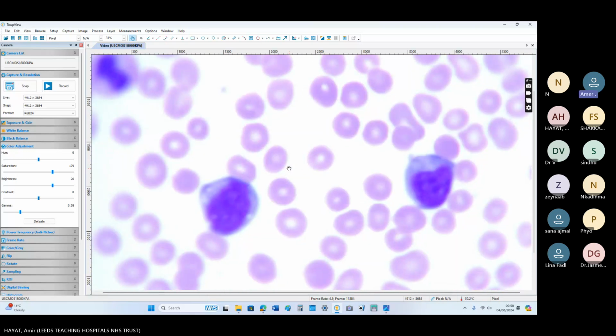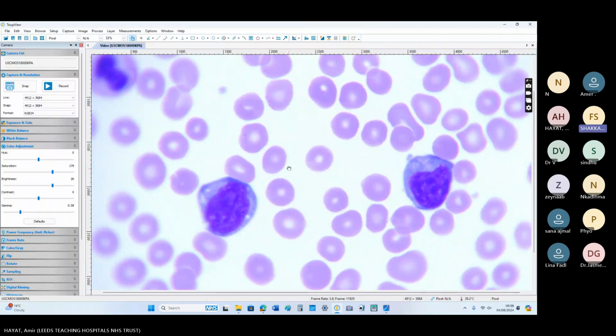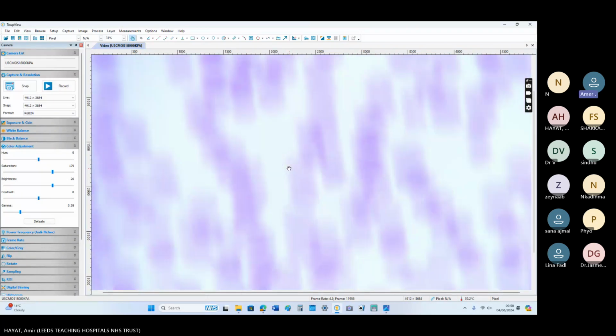So these cells have vacuolation as well, basophilic cytoplasm, large cells. So what do you think are the possibilities here? Yeah, because of the flowery shaped cells, I was thinking about T cell lymphomas, but with the bluish vacuolated cytoplasm. So what is your differential diagnosis here?